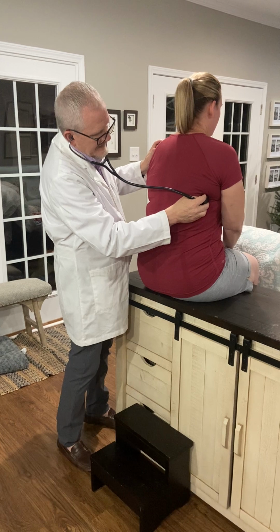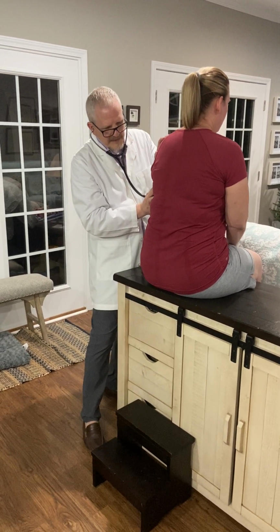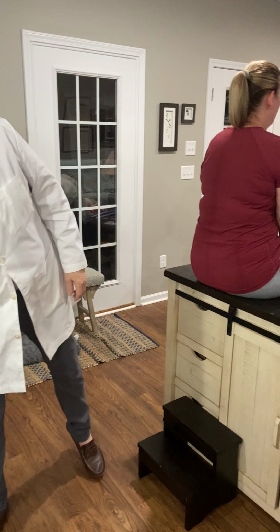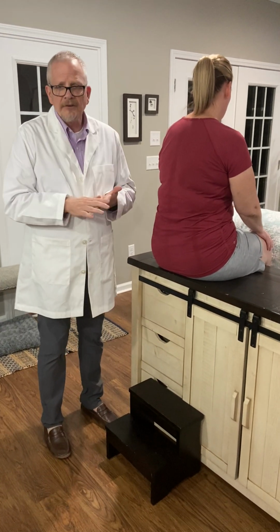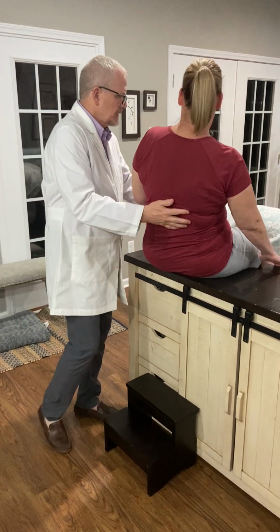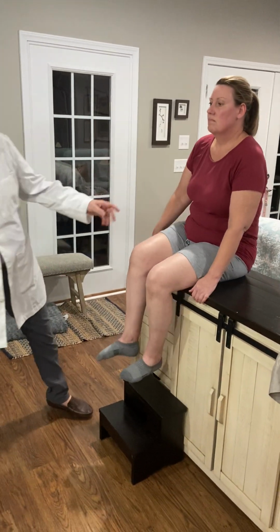6 and 7. Once again, her lungs are clear to auscultation, and there's no respiratory distress noted, and no adventitious lung sounds such as crackles, wheezing, and rhonchi. Okay, if you'll turn around this way. Now I'm going to assess her.